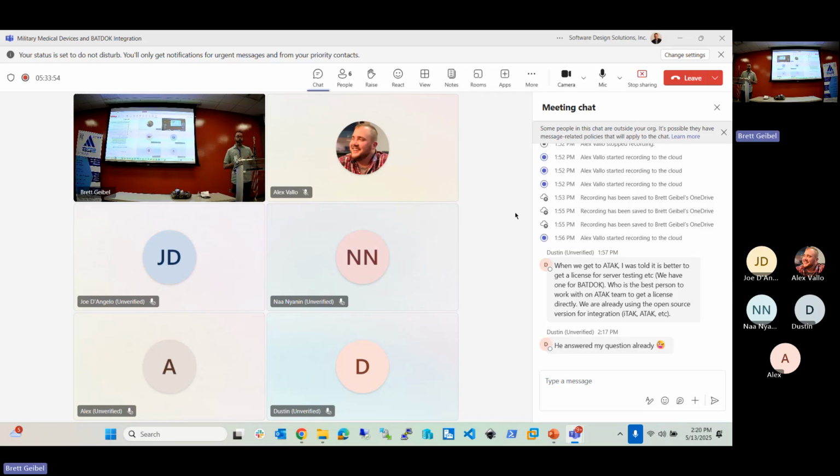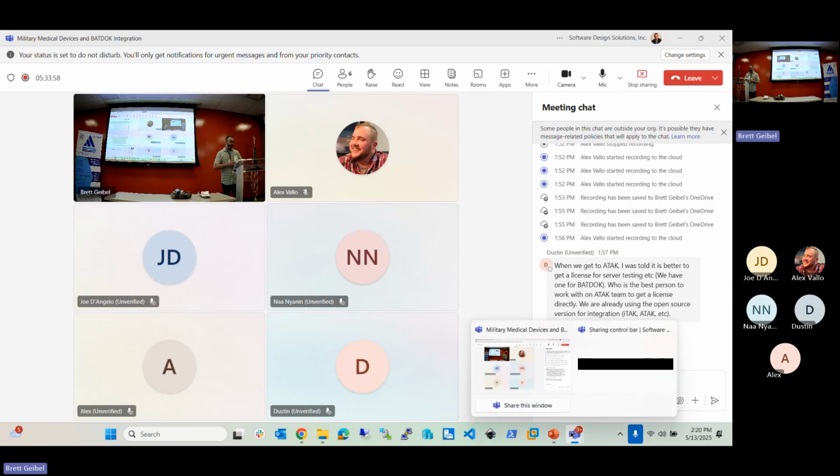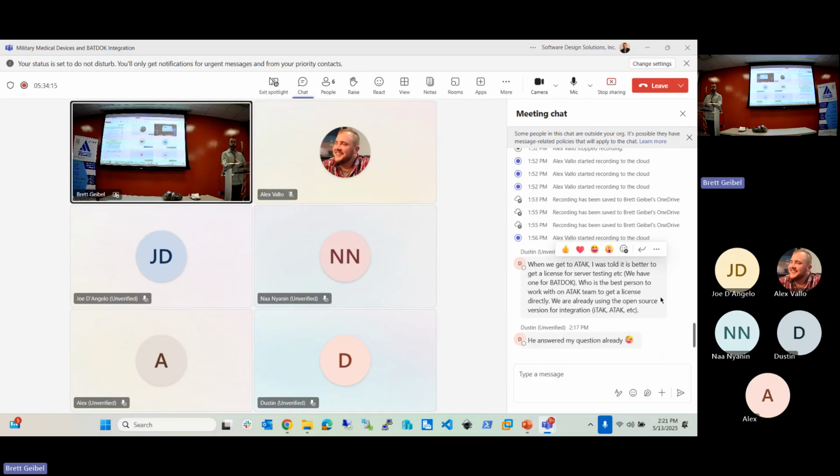So the question was, is there any limit to what you can store on the server and how that gets up there? That is all programmed by the plugins themselves. So none of the data of your plugin is automatically sent up to TAC server. You tell it to go to TAC server, and then you would also have a plugin you built for TAC server.